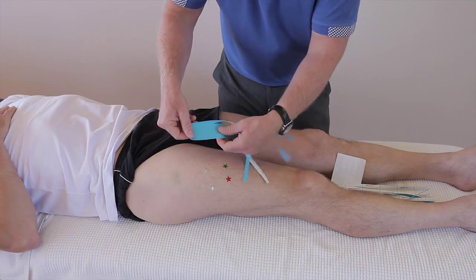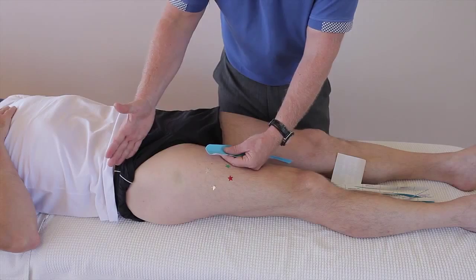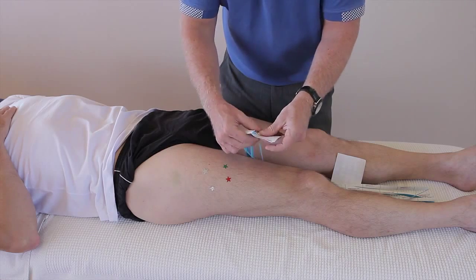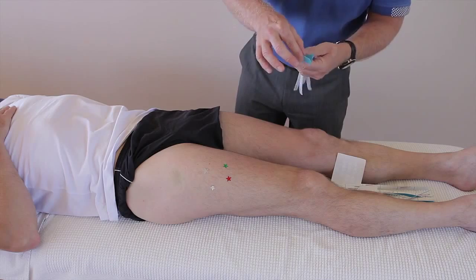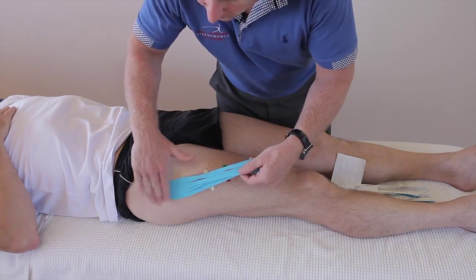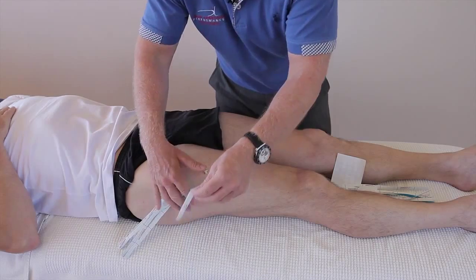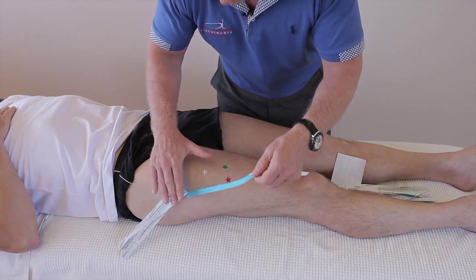When you're looking at the tape, the pad tends to go towards the lymph nodes. In this case, you've got the inguinal lymph nodes, so the pad is going to go towards that. Turn the tape over and individually split each of the 5 fingers. Peel that back and then apply that proximal to where the pain is, like so. So that's the first part. Get the 4 fingers out of the way, otherwise it gets a bit fiddly. So little to no stretch. No stretch on the quad and no stretch on the tape.